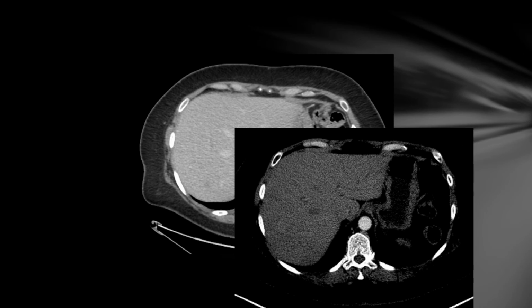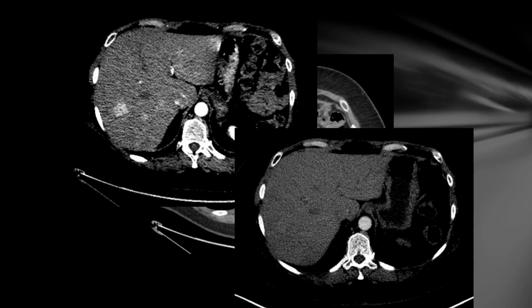that phase. Also didn't show the disease particularly well, even though a CT performed a couple of weeks earlier had shown definite deposits of tumour. So this is just to basically highlight that CT can sometimes be tricky to interpret, and particularly if a scan's done a few seconds later or a few seconds earlier than another scan, it can create uncertainty about whether there actually has been disease progression or there hasn't been disease progression.